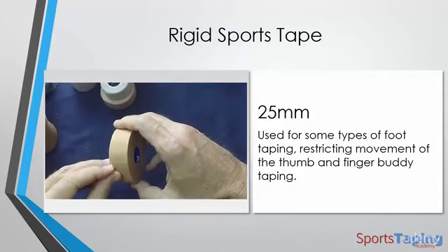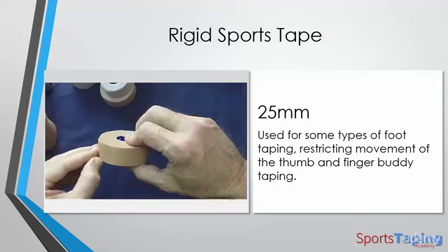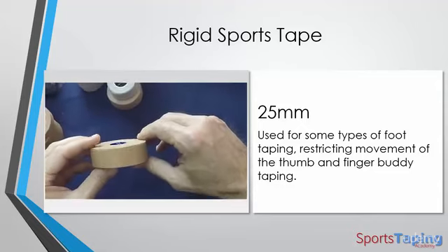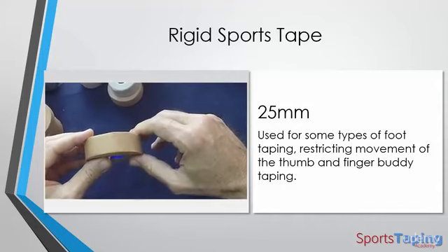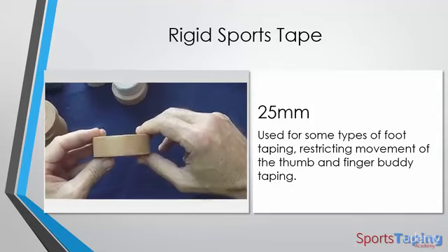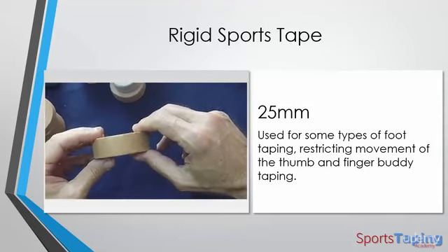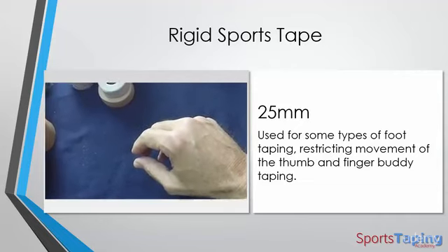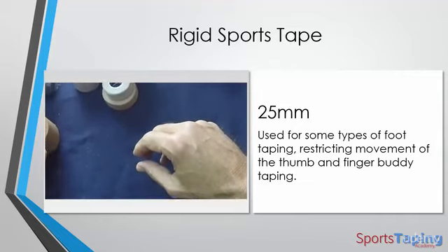This can be used in some specialised foot taping. It can be used to restrict the movement of the thumb and also to buddy tape fingers together. Now these uses are by no means exhaustive. These are just the most common uses that we can use these tapes for.